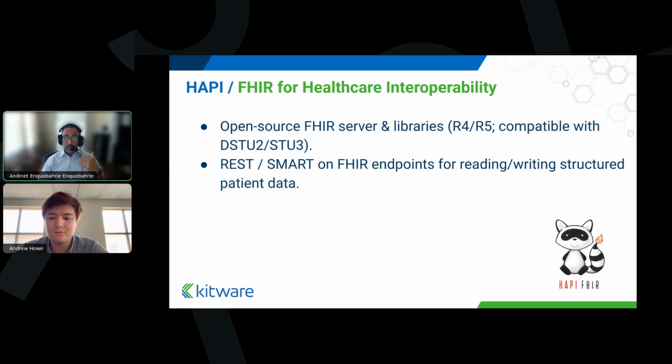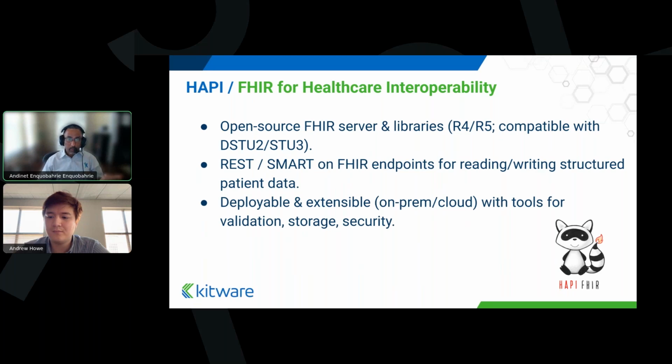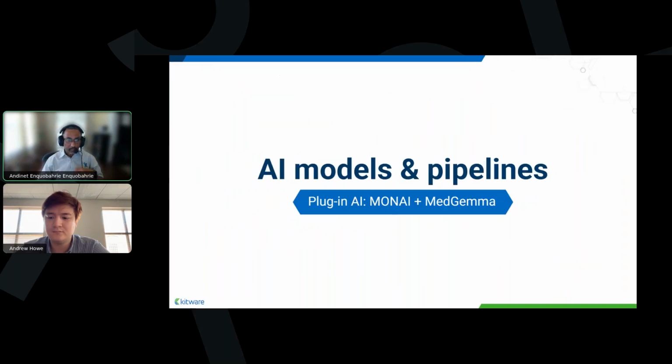And you can deploy it on premise or on the cloud. In our case, we deployed it within our clusters at Kitware. So we'll be using HAPI FHIR as an example of an EHR system that you can use to store your EHR data and then retrieve your EHR data.